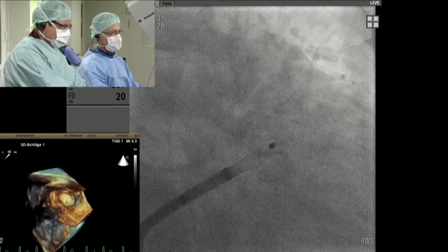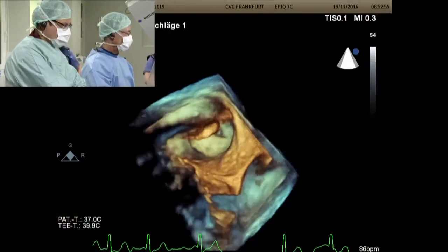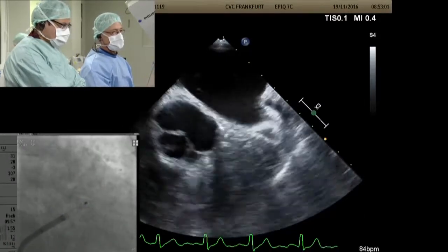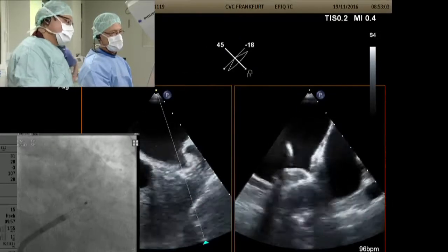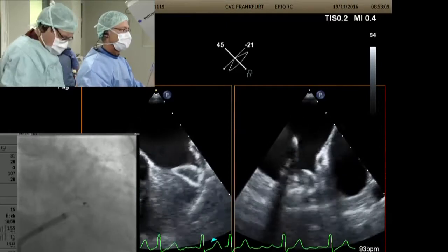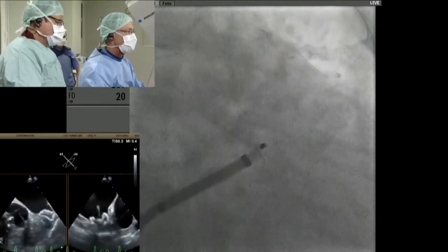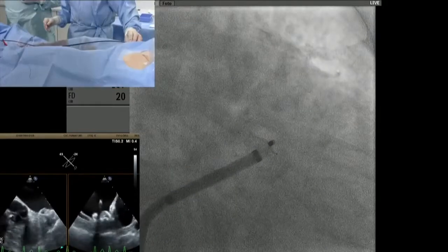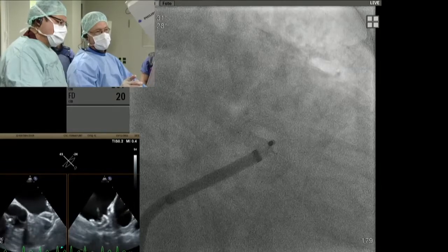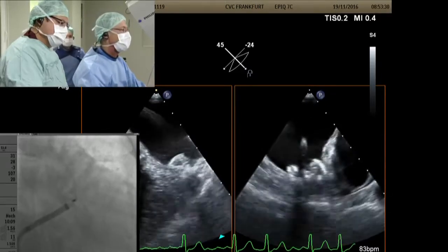Kevin, and then Iqbal? Yeah, it's obviously usually worth another deployment to see if you can get a different angle. But I think the septum between the lobes is making the landing zone very short. And I think you'd end up having to go down to an 18 to get distal into that lobe, and then your disc is going to be maybe too small to cover the inferior part. Iqbal? I was going to make the same point, or an 18 device, or switch to a Lifetech. Okay. So an 18 device would be too small to cover the orifice, right? Do you agree? Yep. Here you see again on the 135 that the lobe is actually outside, at the inferior edge it's outside of the appendage, and that is just because of the ridge between these other lobes.